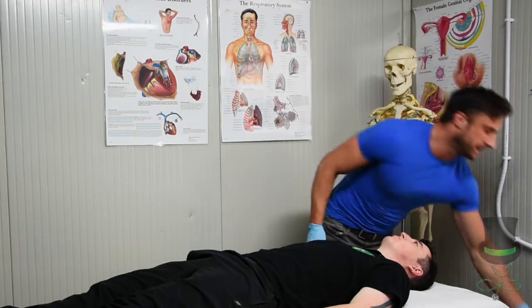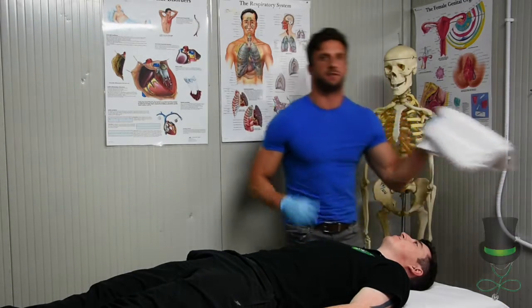First thing you need to do is get a sheet or towel to protect the patient's clothing.